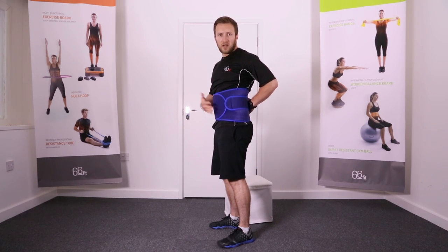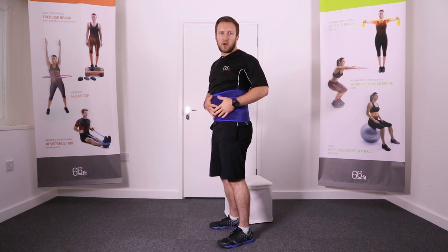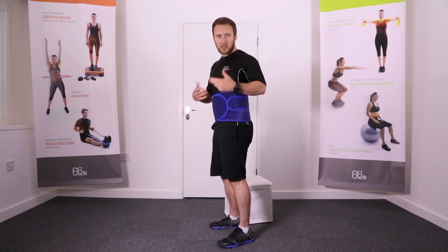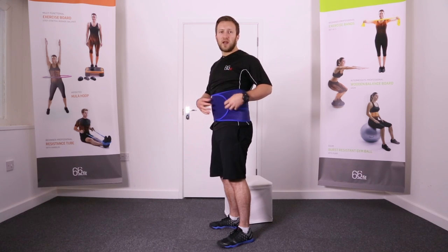It's really going to hug you in and hold you in place and provide the support that's needed to your back if you've injured it. Due to the nature of the materials used, it's also going to keep your back nice and warm throughout the day. If you want to wear this underneath clothing you can — it's nice and low profile so with a t-shirt and jumper on you'll be able to walk around wearing it no problem. If you'd like any further information on this product, please refer to our YouTube channel.